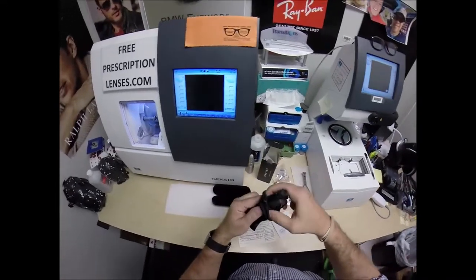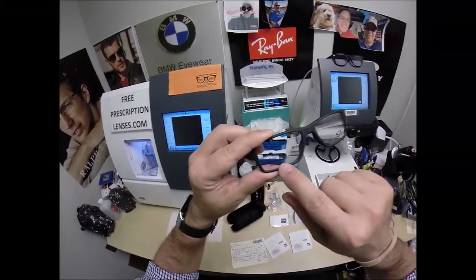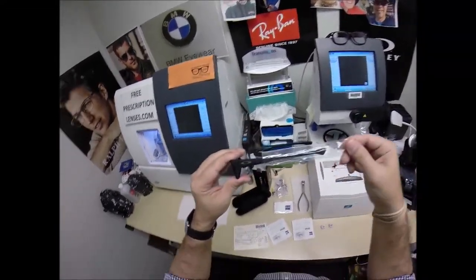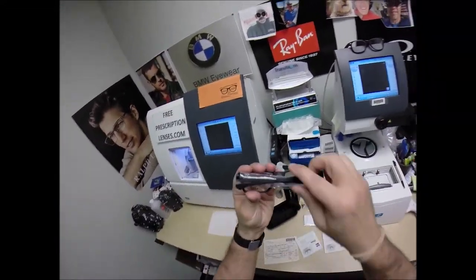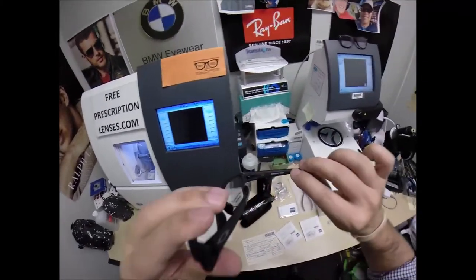Let's take everything out. Now we can finally get to the star of the show, the main attraction with the interchangeable nose pads. It comes with a little plastic sleeve on the left temple to protect the temples from rubbing together during shipping. I'm going to put that on there when I ship to you.